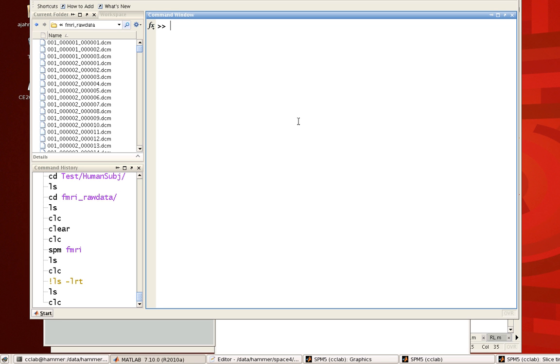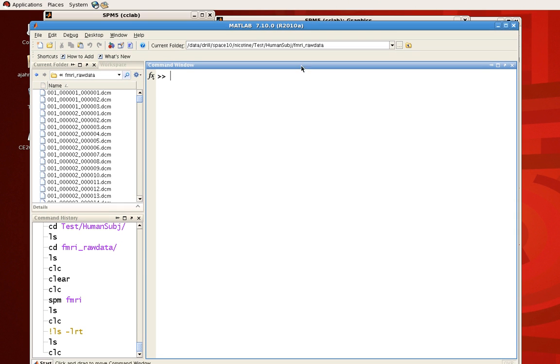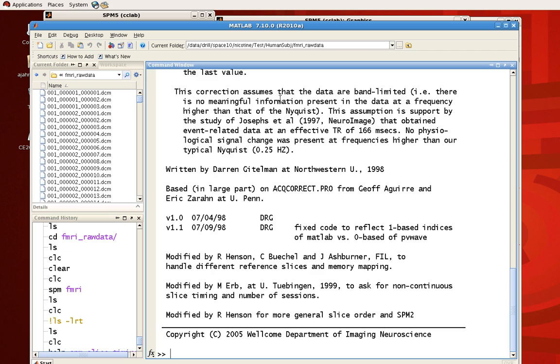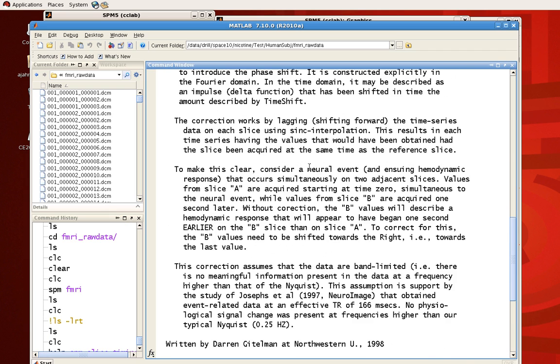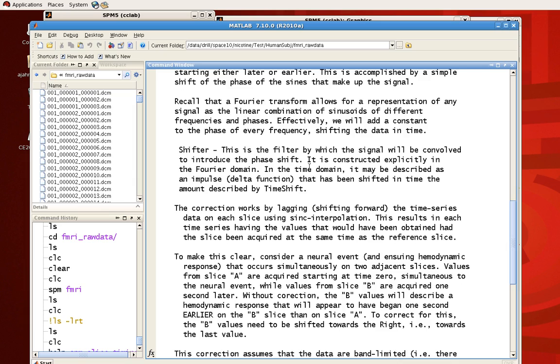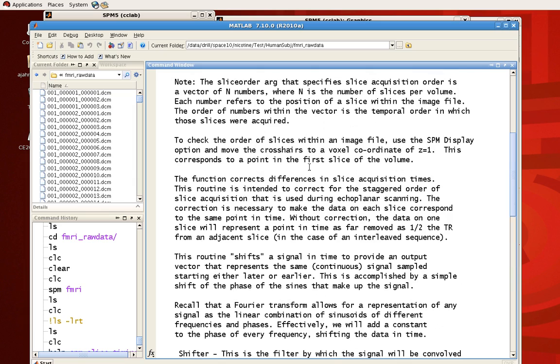In the previous tutorial, we talked about how to do slice timing correction in SPM through the graphical user interface, but you can do it from the command line as well. Sometimes it can be much faster, especially if you are processing it as part of a batch script. The command itself is called spm_slice_timing. You can click help and see all the details about what arguments it needs and how you operate it.